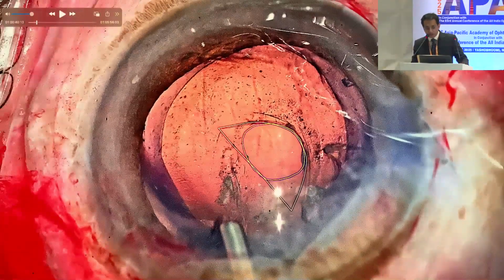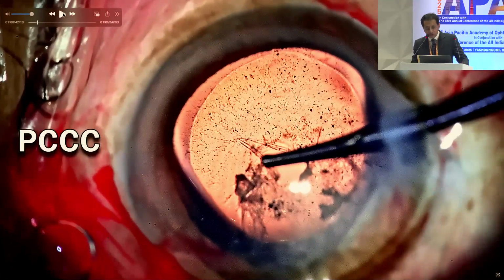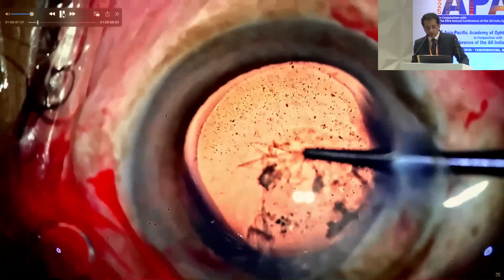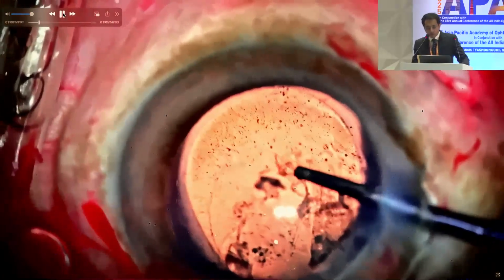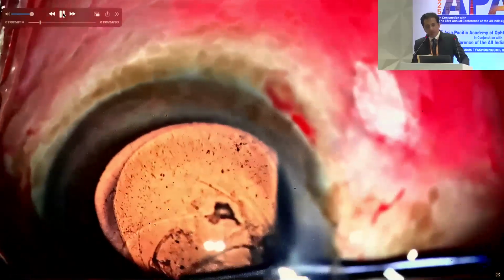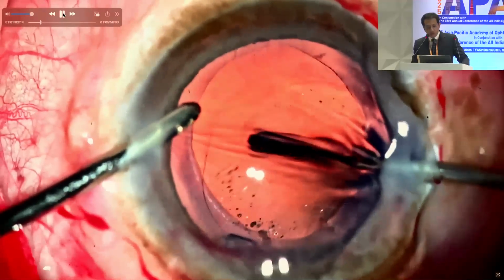We can clearly see this round circular thing, which is the anterior hyaloid rupture, and this is the posterior capsular tear here. This is the stage at which you push in OVD to push back the anterior vitreous face and then perform posterior capsular rhexis. If the vitreous has already prolapsed out, you cannot do the posterior rhexis now; you have to perform vitrectomy and then the posterior capsular rhexis. But if the prolapse is very minimal, you can push it back with the OVD, perform the rhexis, and then perform the anterior vitrectomy.